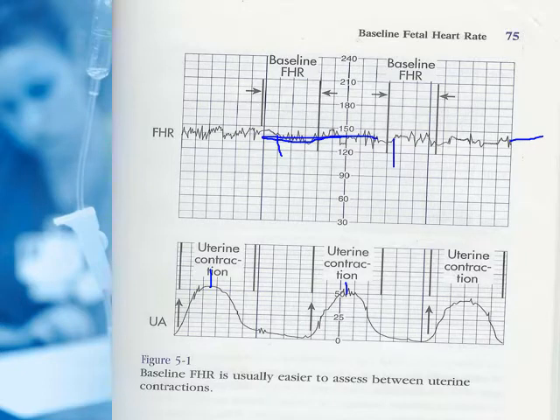If you said 140, you'd be right. Now you see there's a variability, up and down, up and down. That's normal. We have to have that. Your heart rate as you sit there and move or think or blink is doing that as well. So the baby's got really good variability, which we'll talk more about later. We like this good variability. So we're going to look at the overall, where is it hanging out to determine our baseline. And for this, I would say 140.